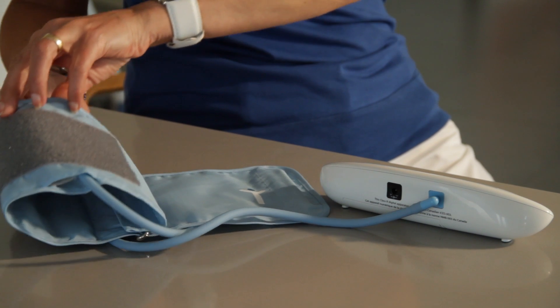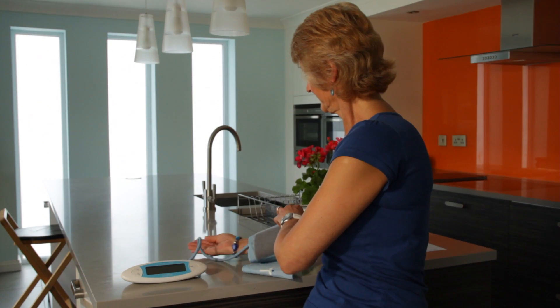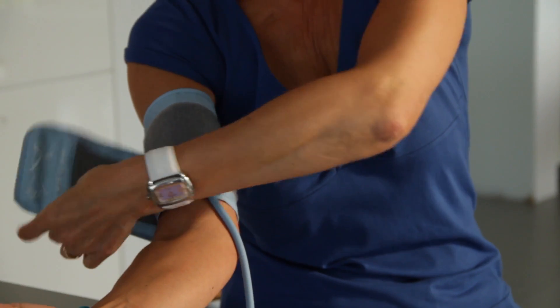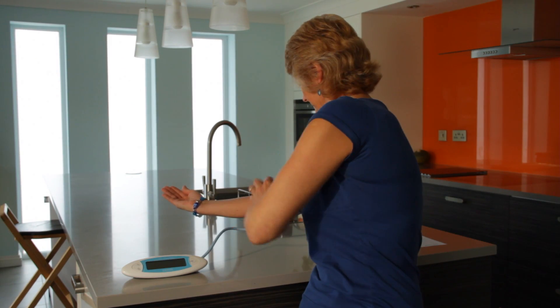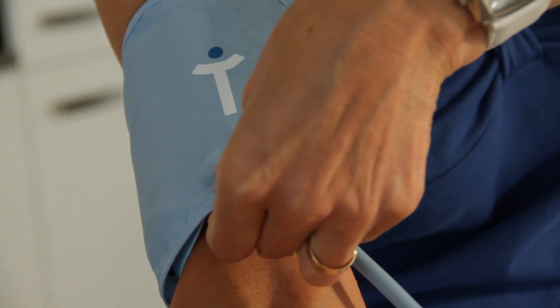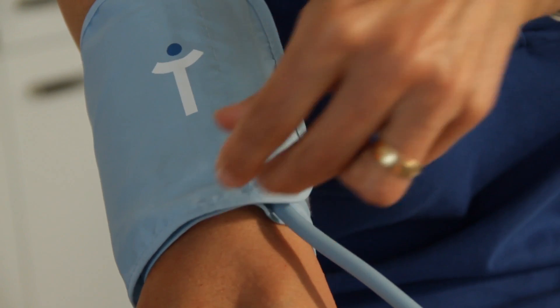Unless you know of any medical conditions that will prevent you having your blood pressure measured in both arms, the British Hypertension Society recommends that for your first test, you should test both your arms. This will determine which arm should be used for future measurements.